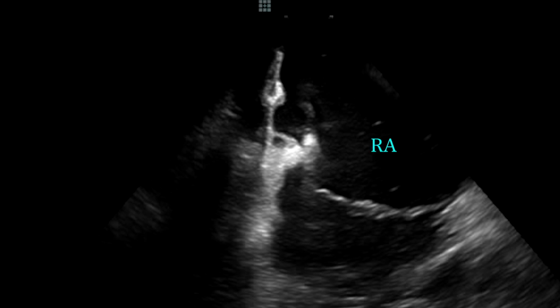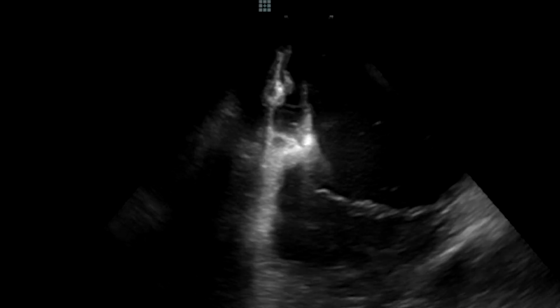This is another case. If we pull back this ablation catheter towards the IVC, here is usually going to be the trajectory, and you can appreciate that we are going to have a defect. The catheter may not be able to touch the floor of that pouch if we don't recognize it on ICE, and that is the area that we may not be able to ablate.